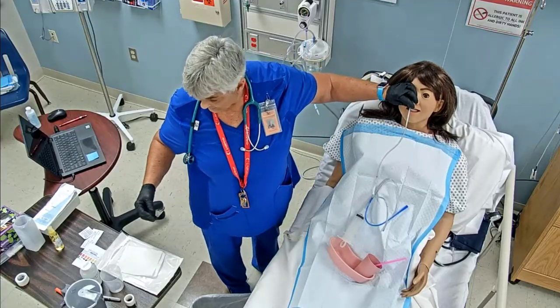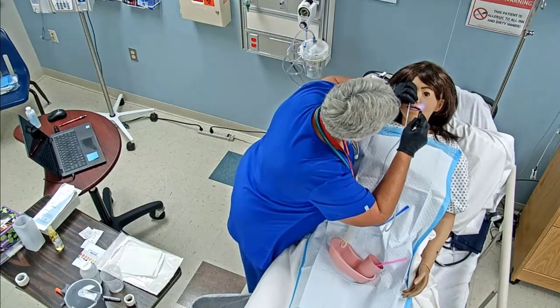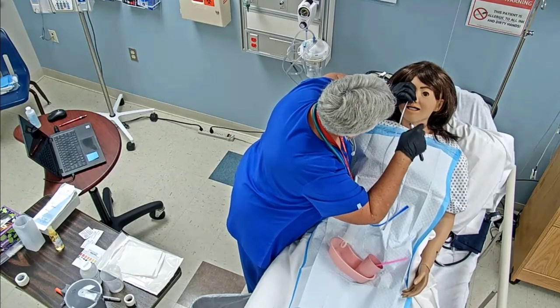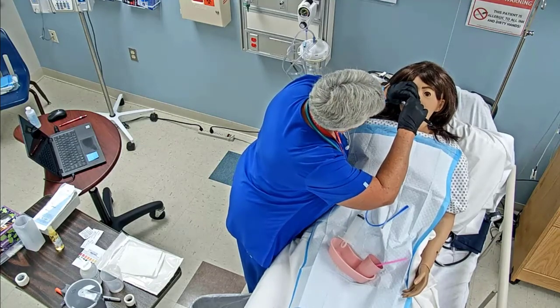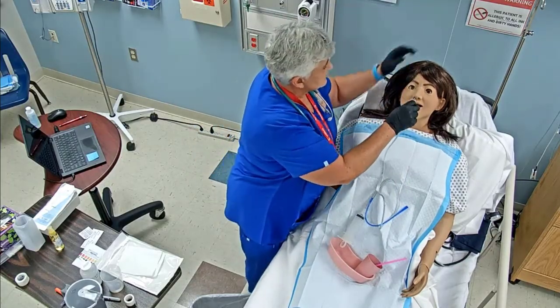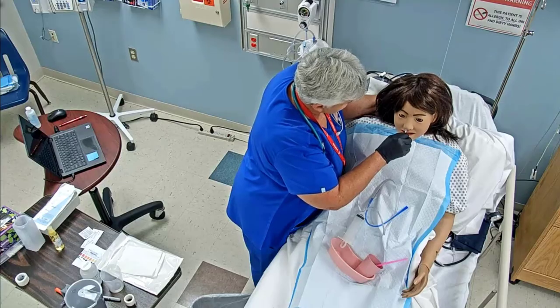And if we need to do that, I'm going to hold that right there. I'm going to pull back just a little bit. I'm going to get my pen light, okay? And I'm going to have you open your mouth, okay? And I'm going to look to make sure that the NG tube hasn't curled or coiled in the back. And if it has, I'm just going to twist and get it straightened out. Okay, so it's straightened out now. And so we're going to go ahead and continue. So get your chin to your chest, and every time you take a drink and you swallow, we're going to advance.